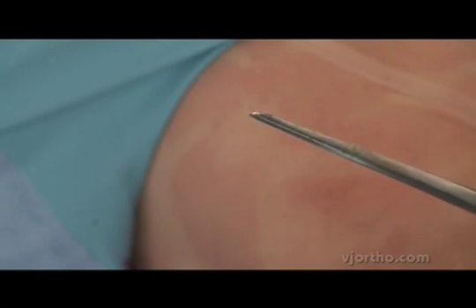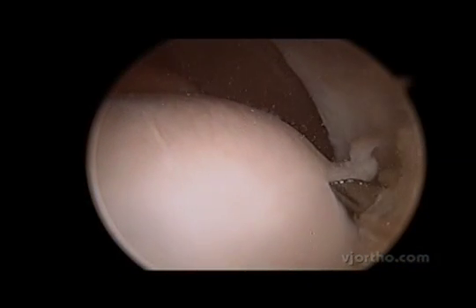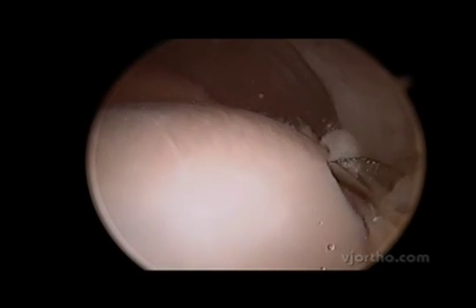This is a 4mm gouge with just a sharp end, inserted into the knee through the medial portal. It's very important to get down to the subchondral bone and just to walk it forward on the subchondral bone without trying to dislodge it. I like to keep it hinged either distally or laterally so it doesn't fly off into the joint.